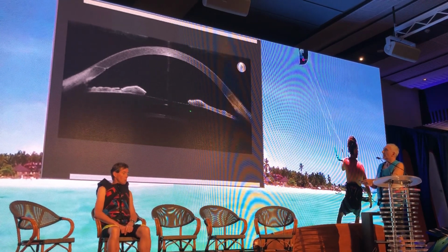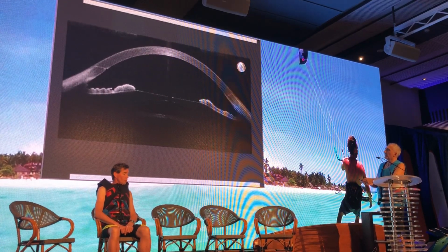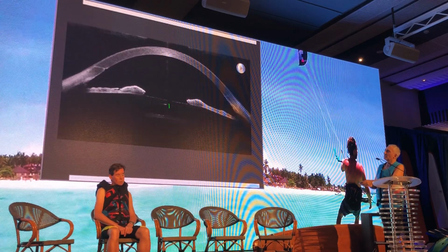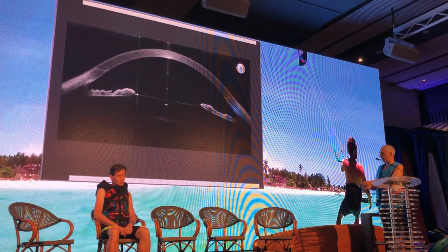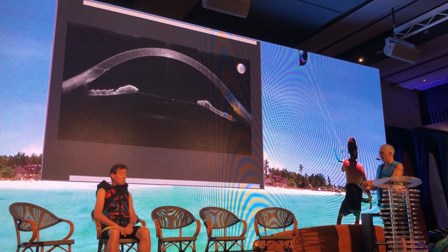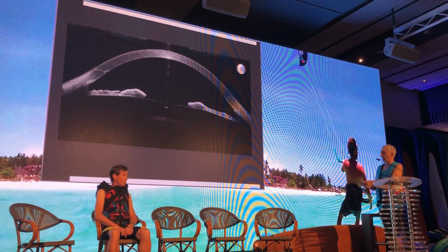This is also very nice. Besides looking at the angle, it's very nice to have a look at what happens to an ICL with quite a bit of vaulting, and you see what happens when there is constriction with light. This is some information that might be very useful to have, besides the measurement that can be done anyway.